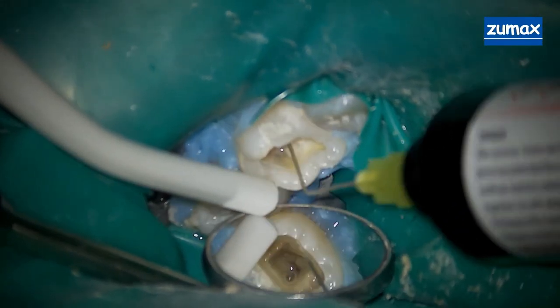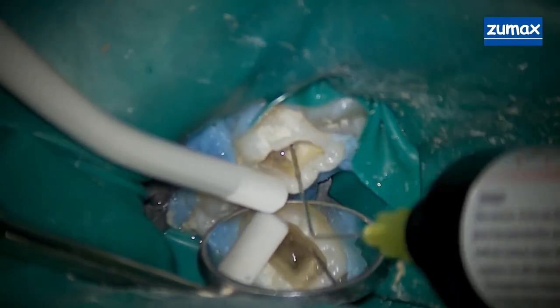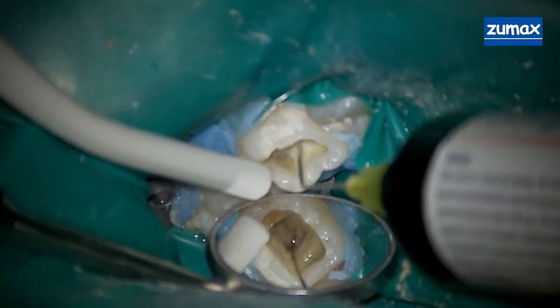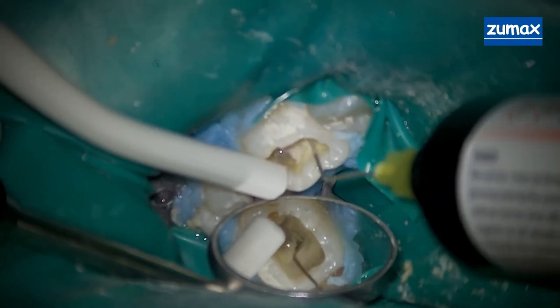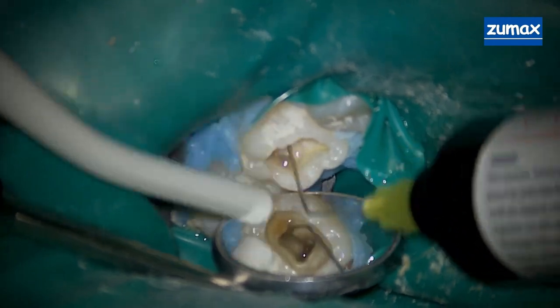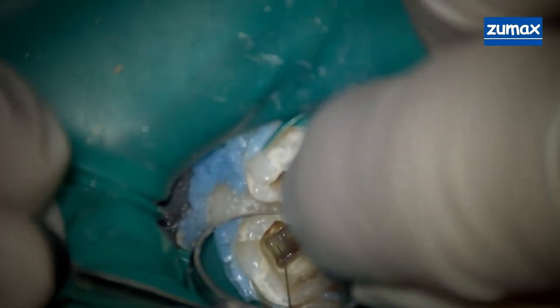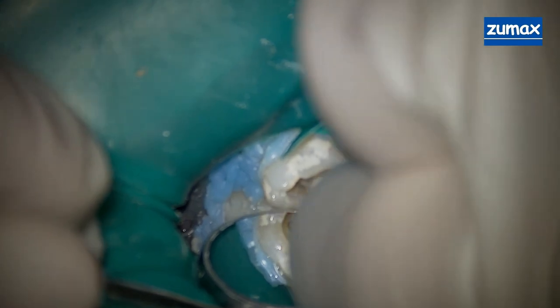At this point we're using sodium hypochlorite to irrigate the pulp chamber and also to get a little bit into the canals. The focus here is to make sure that our working area is as clean as possible. The sodium hypochlorite will help us irrigate and keep the area clean.